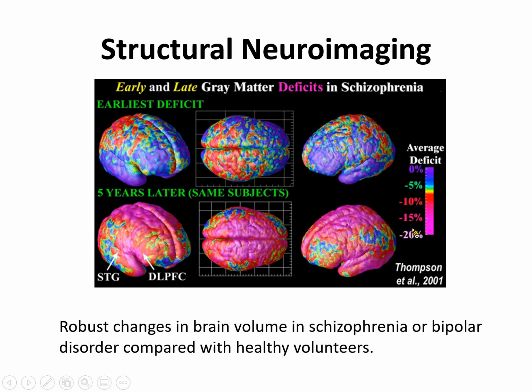Okay, so for this analysis, we can do very detailed comparisons of the intensities or probabilities in each voxel for gray matter or white matter. For many studies, they found that patients, for example with schizophrenia, actually have a reduction in gray matter volume after the onset of the illness.